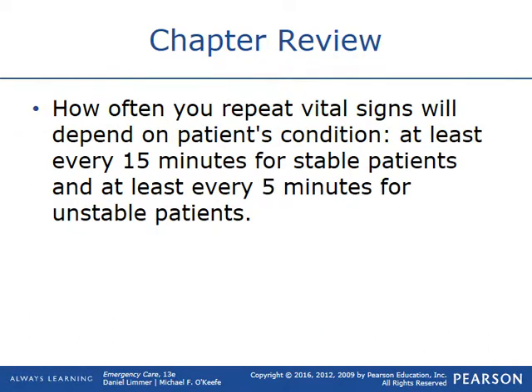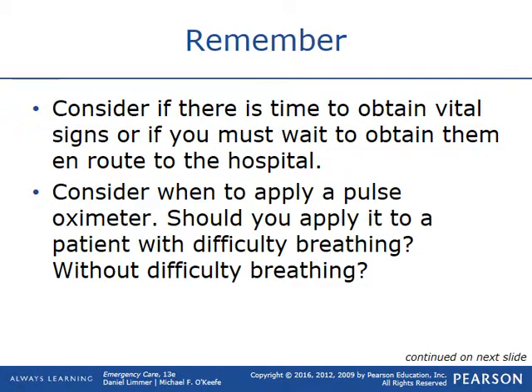How often you repeat the vital signs will depend on a patient's condition. At least every 15 minutes for stable patients, and at least every 5 minutes for unstable patients. Remember to consider if there is time to obtain vital signs or if you must wait to obtain them while en route to the hospital.